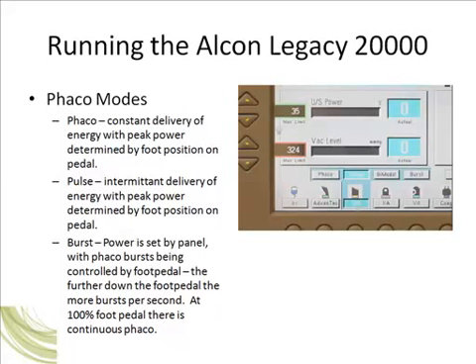The phaco energy will always be delivered at the maximum preset level on the ultrasound panel. However, as you depress through foot position 3, the bursts of phaco energy occur closer together, such that when you get to 100% foot position, or pedal to the metal position, you will have essentially continuous phaco energy.